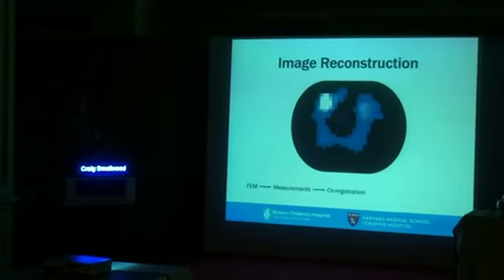So next, there's a process of co-registration, which is basically just translating those triangles into now squares, and we can kind of pick up a few more blocks. We're increasing the resolution a little bit. And then you run some filtering. And then finally, you do some interpolation, which is just an averaging. So it's the same as averaging a few numbers. If you average 2 and 4, you get the average of 3. Well, we're doing that now, except in 2 dimensions. So this is what the image is going to look like when we look at the device this afternoon.